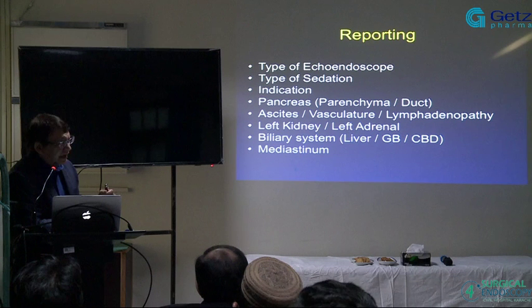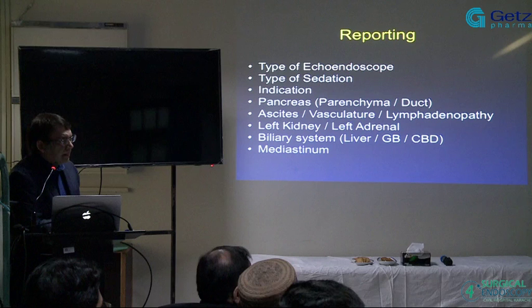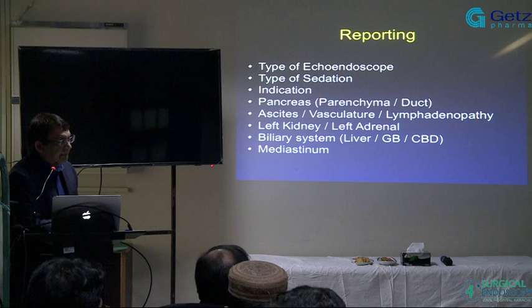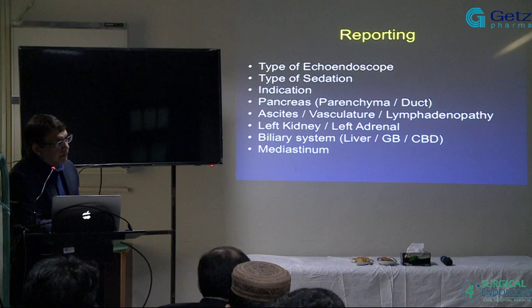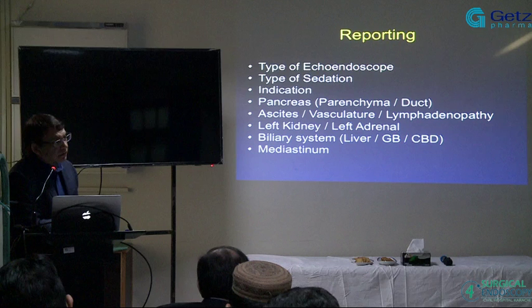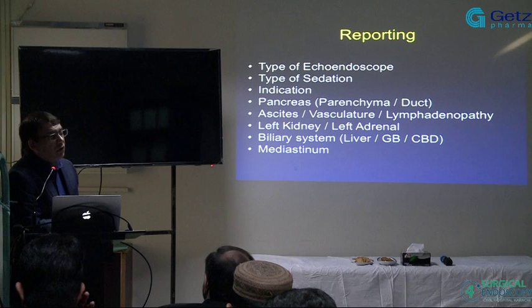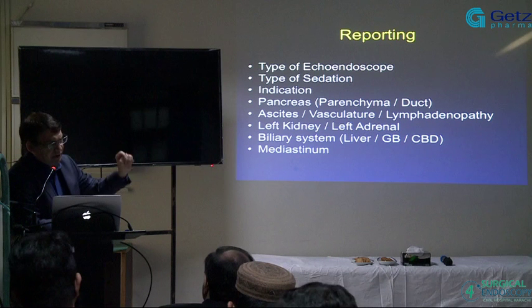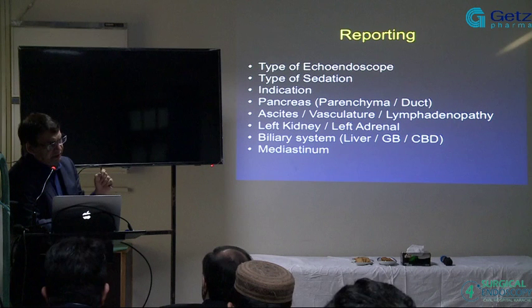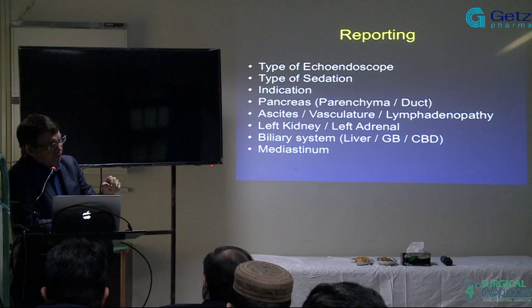Okay. Mediastinum, yes. If you find a mass in the pancreas, and also there are some nodes that may be nodal mets, and there are also lesions in the liver, will you sample all of them? And if yes, which one first? So nodal, no. There's no need. There's no purpose of doing that. The main goal, because they're going to be peripancreatic lymph nodes. If it's a celiac lymph node, that's a different story.